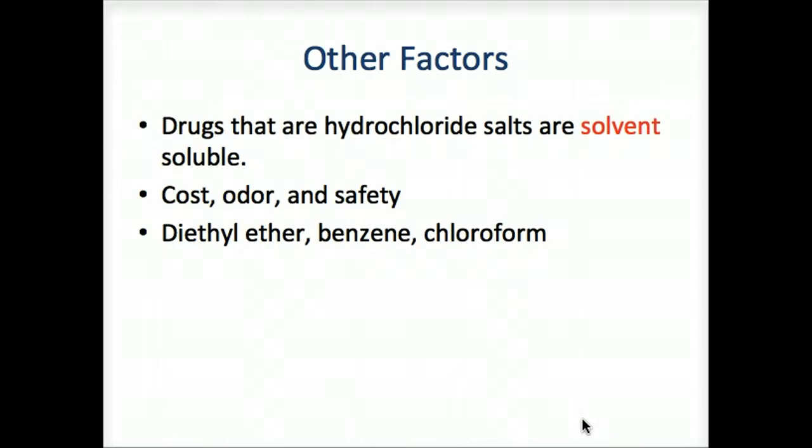Other factors: some drugs that are hydrochloride salts are solvent soluble, particularly in chloroform, 1-chlorobutane and dichloromethane. Some high molecular weight drugs such as thioridazine form hydrochloride salts that are solvent soluble. Other considerations with liquid-liquid extractions include cost, odor, safety.